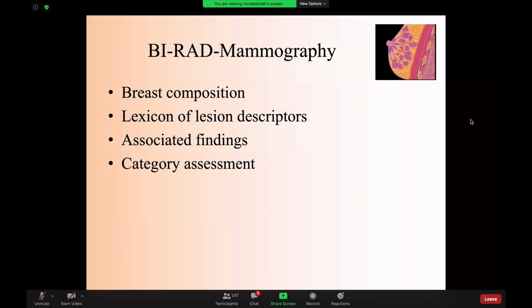When I used to be a resident, breast imaging was one of the worst subjects that I didn't like. I always felt that it was a bit difficult. We didn't have good teaching. We didn't know how to characterize lesions because we didn't study the lexicon very well. And when I did my fellowship, I completely understood from the first day. Once you understand BI-RADS, it will be very easy for you.